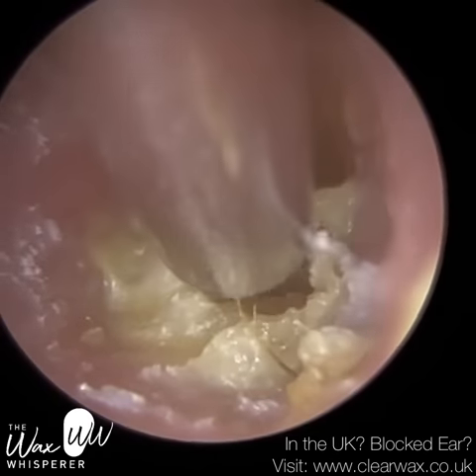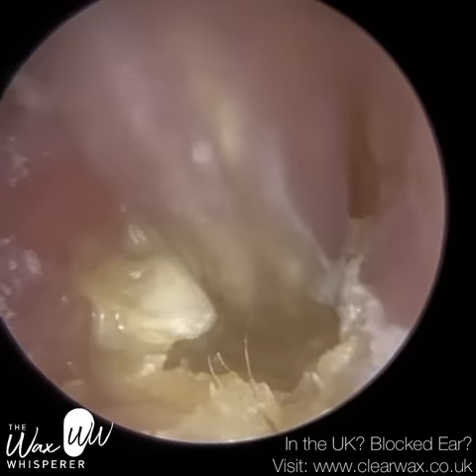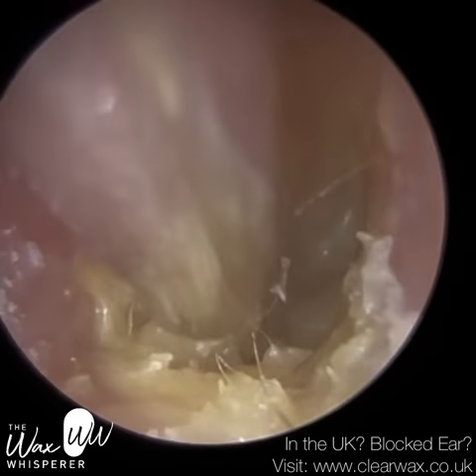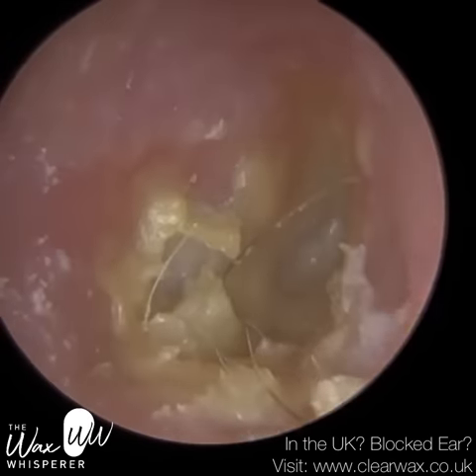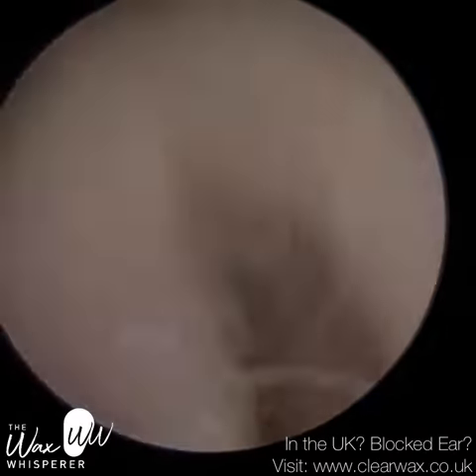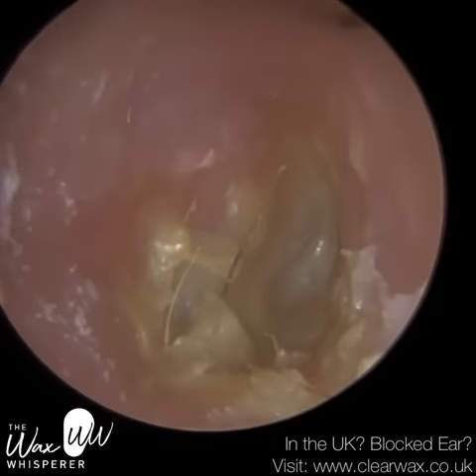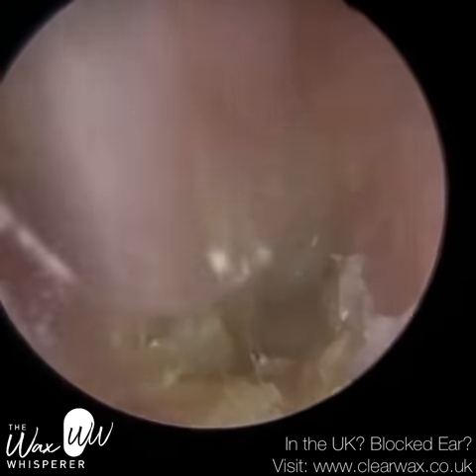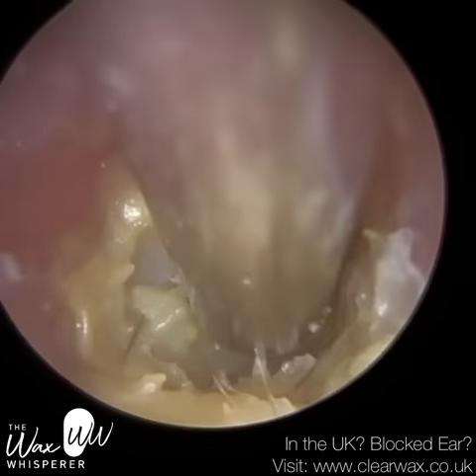There's so much bleached wax — it's discoloured. There's a lot of skin here. You can see the skin surrounding the ear canal is irritated, with dry skin flakes. That's not fungal spores — they can be mistaken. Fungal spores are very spherical; these are just dead skin cells because the skin has become irritated. And I can just about see the eardrum in the distance, but we've got all this thick, creamy debris that I'm going to now remove off the eardrum.